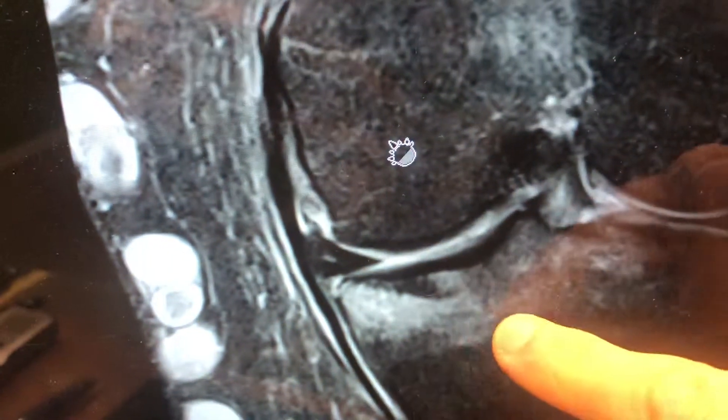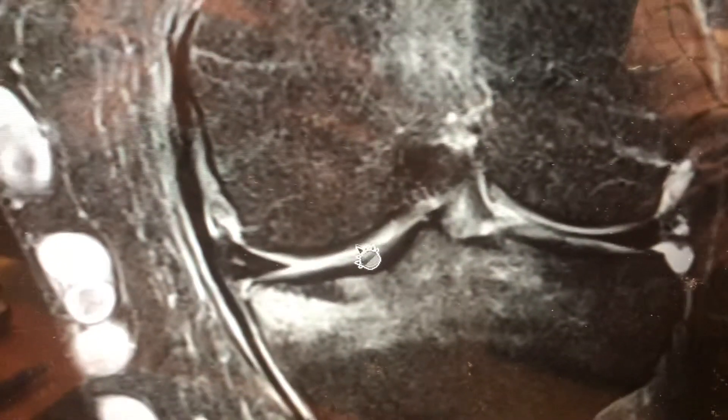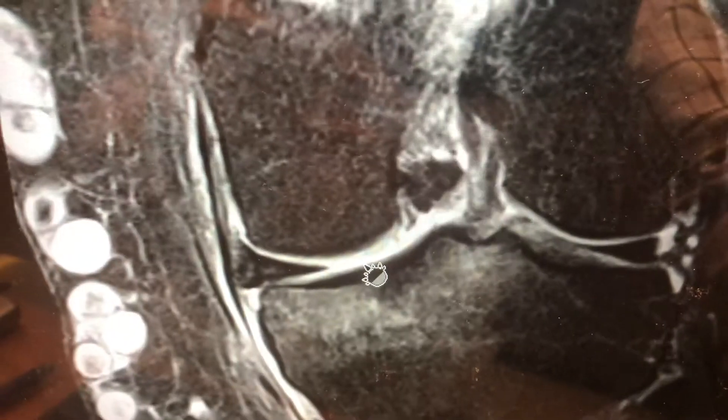It causes a swelling and it causes a trabecular fracture. But the main reason was, once again, because of this root tear.